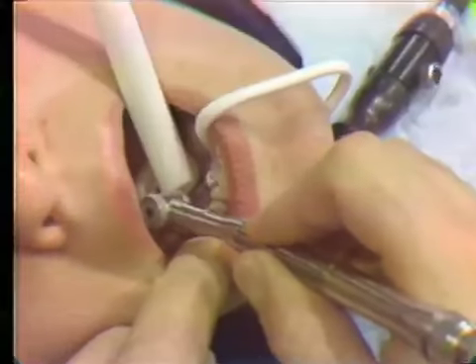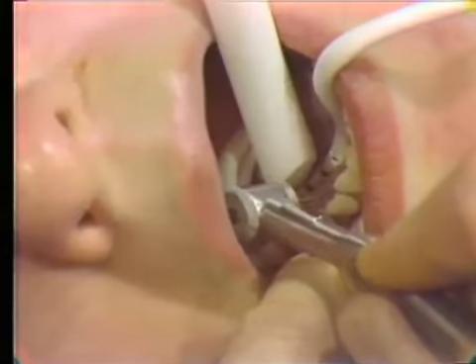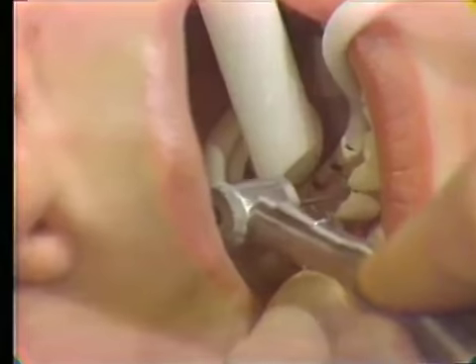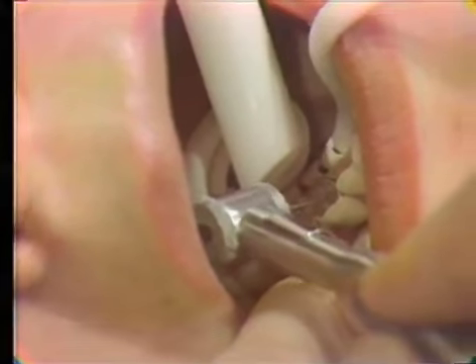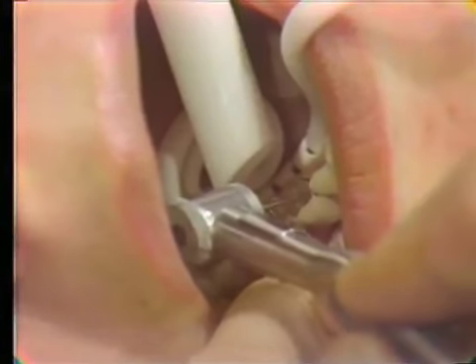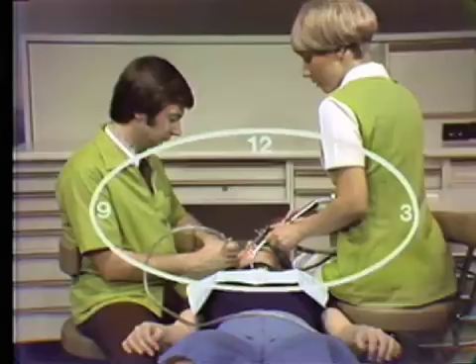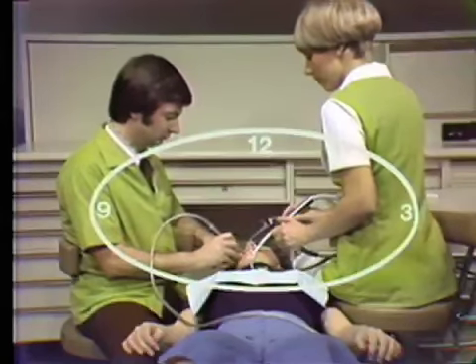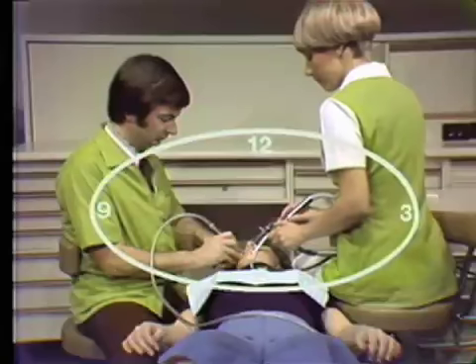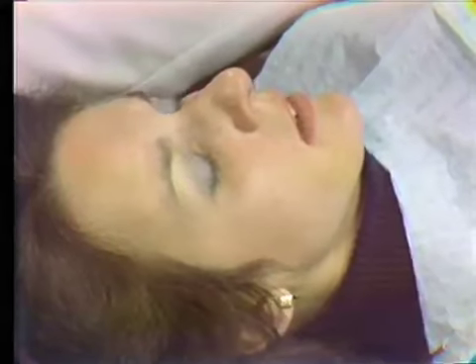Direct vision is used for the most part during cavity preparation. Indirect vision can be used as a supplemental approach to visibility during inspection of the fine detail of a preparation. The operator generally works from the 9 o'clock position. The chair base is lowered completely and the patient's chair back is raised to position the oral cavity at the height of the elbow of the operator. The patient's head is turned slightly toward the operator with the chin lowered slightly.